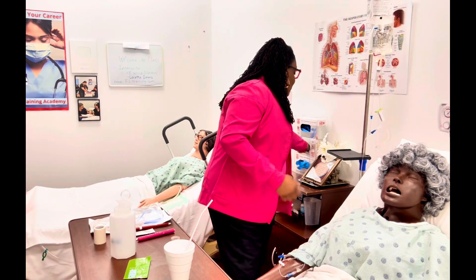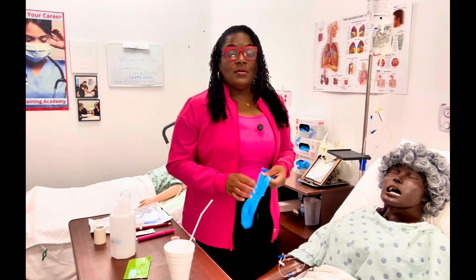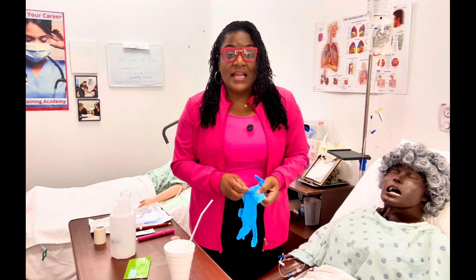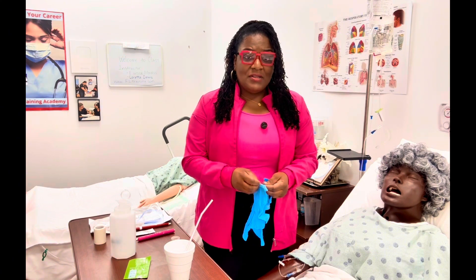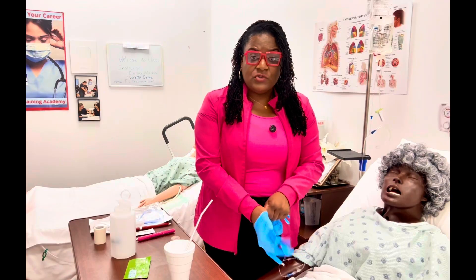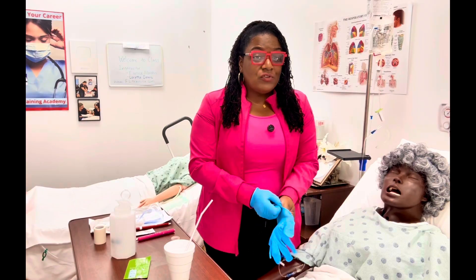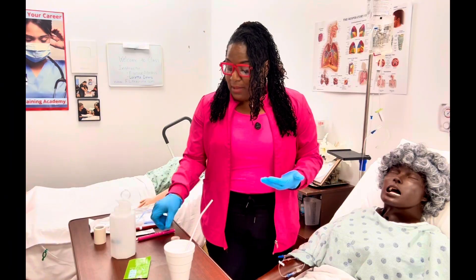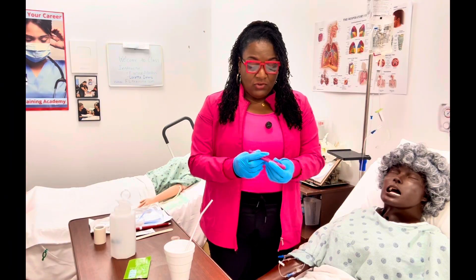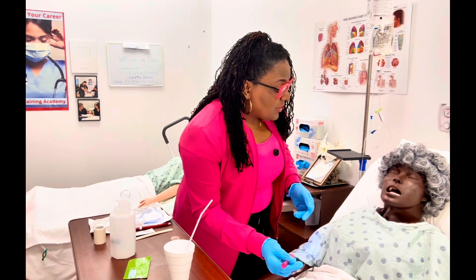Let's get started. I've already washed my hands and I'm going to glove up. I've explained the procedure to the patient. Whenever possible, have your CNA or tech in there with you because this can be a little traumatizing. Some contraindications include nasal trauma and facial trauma — we will not insert an NG tube if a patient has a nose or head injury. Also ask about polyps or anything that would make it unsafe.